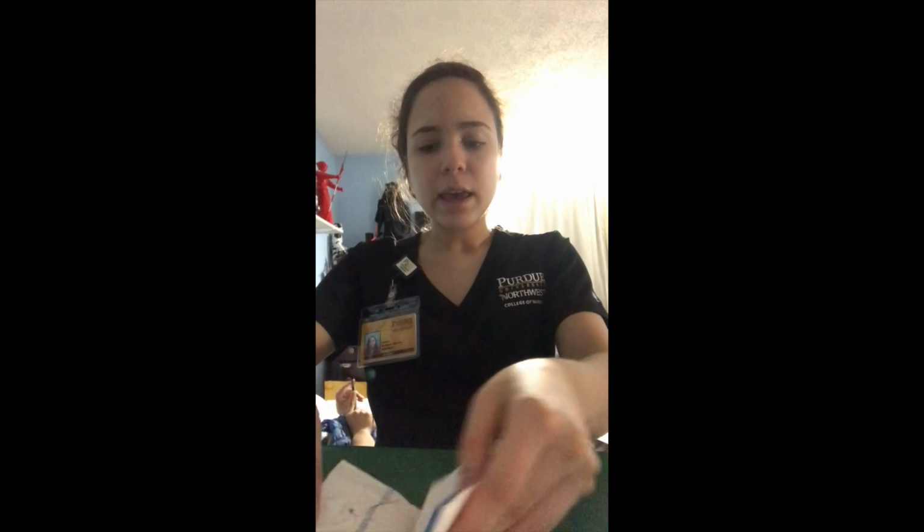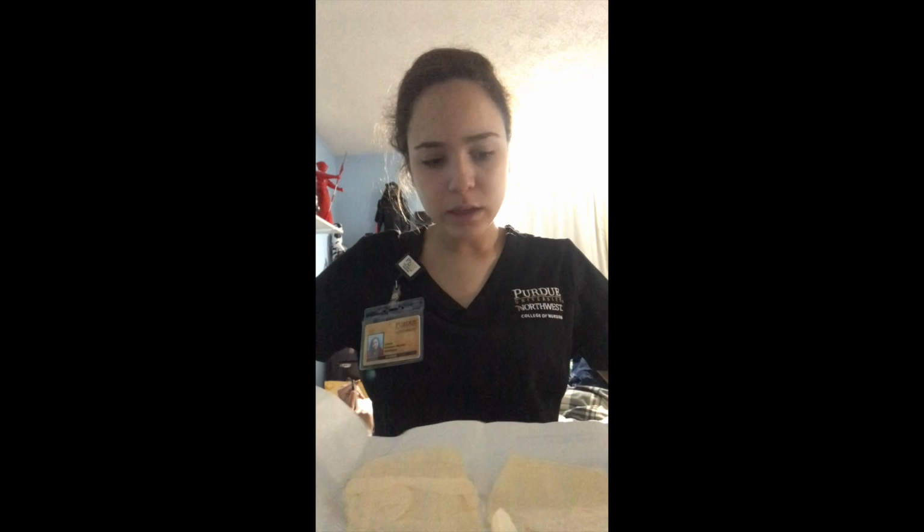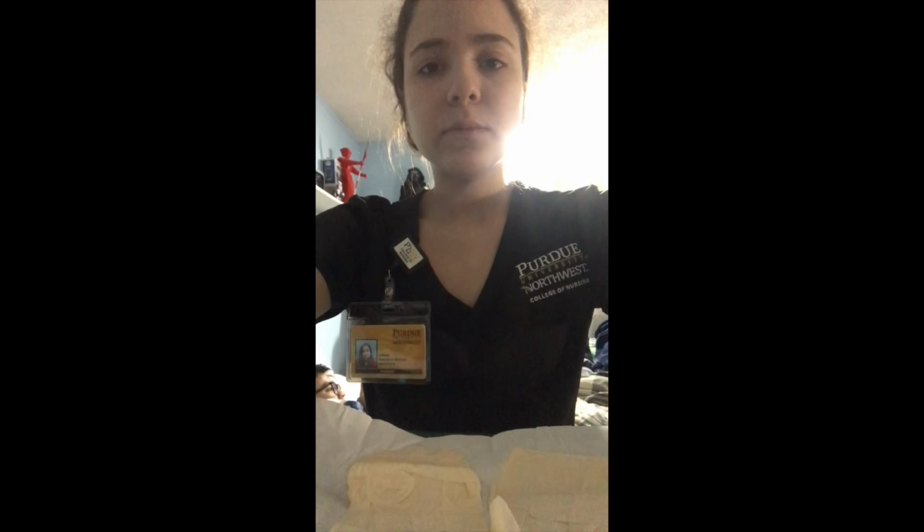And I need to fold my gloves. The gloves normally show where the cuff is, so I need to put this close to my hand, and I need to open it. I need to make sure not to touch my sterile gloves. So I just open the edges, making sure not to touch anything else. So it's open, and you should not touch here in the middle, just the edges of your sterile gloves.